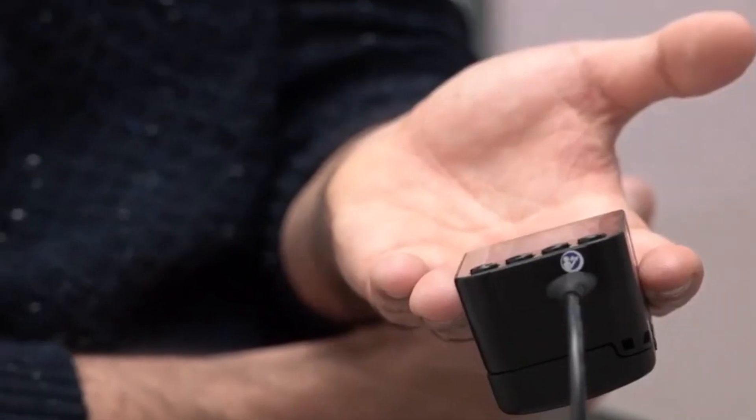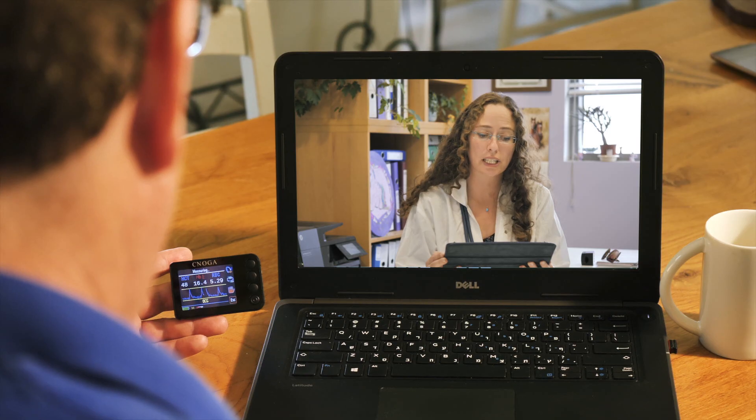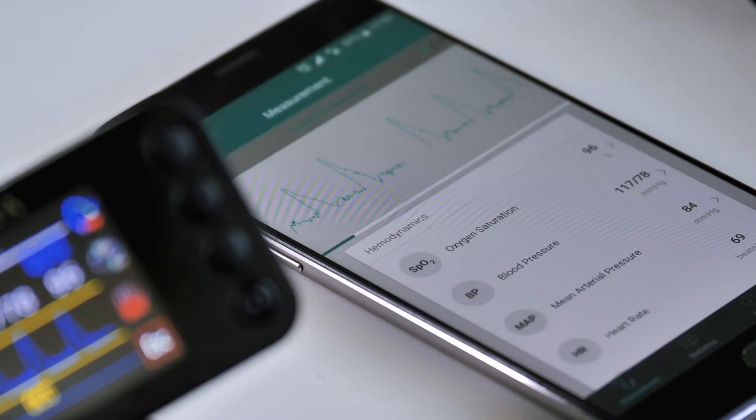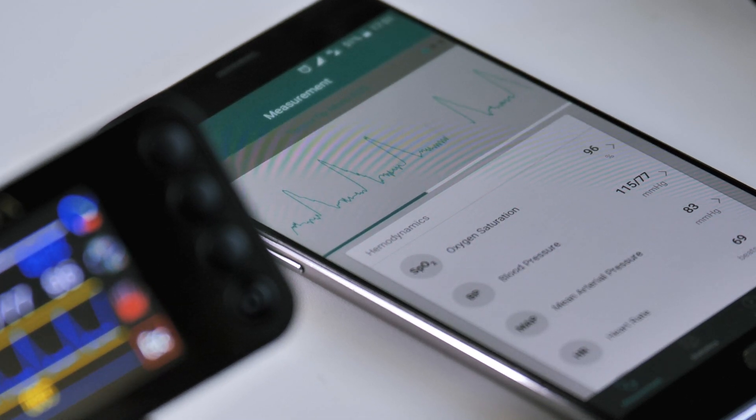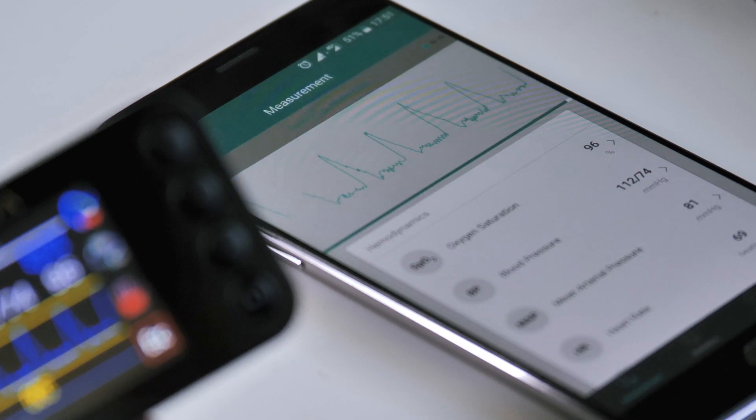MTX can be used by healthcare professionals for vital signs observation in their clinics and for remote monitoring of their patients at home. By using the Singular mobile app, all the data can be stored and analyzed in a secure cloud platform that will allow better health monitoring.